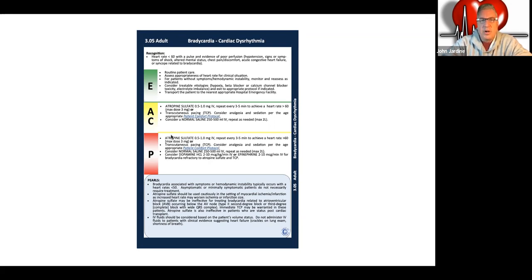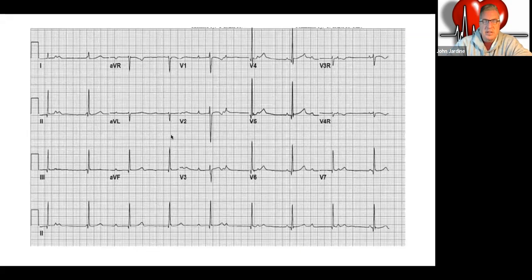The important thing to know about this ECG is, what's her blood pressure, right? So if you come in with this lady who had just had syncope at home, she has this ECG with complete heart block and her blood pressure is 120/80. Well, then we're not as concerned as if she had a blood pressure of 50, right?